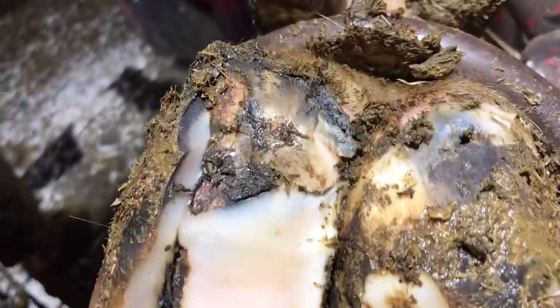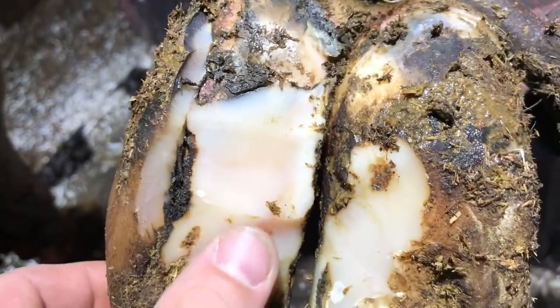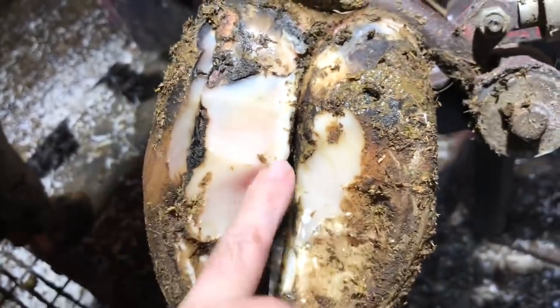So at first glance it appears like we've got a white line defect here and we've got some dermatitis behind that once again. So let's get back to work on this, remove some more of this loose stuff and get it cleaned up properly.